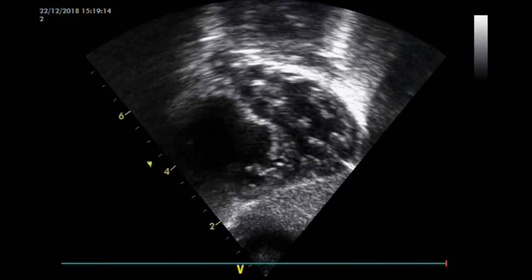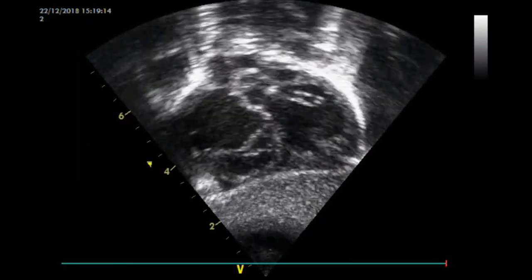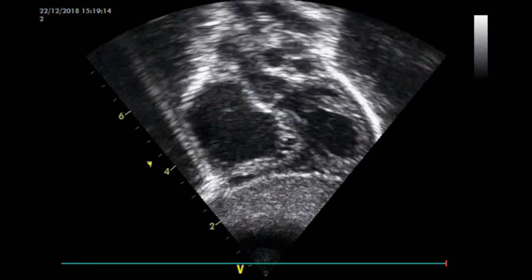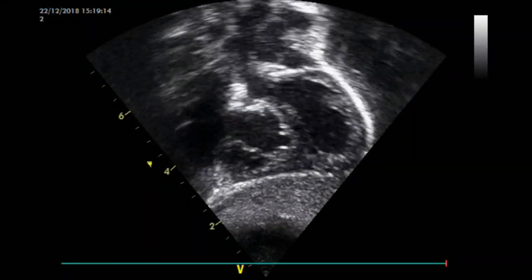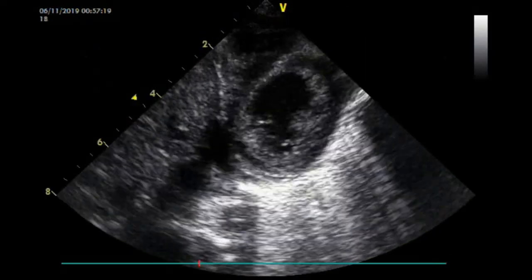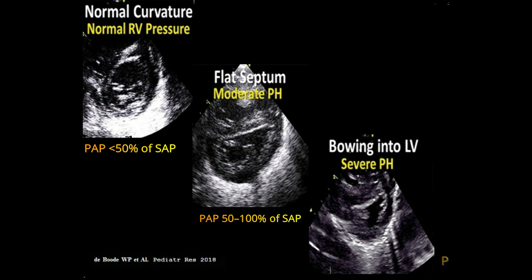In these cases, an alternative estimation of pulmonary arterial pressure is based upon the alignment of the interventricular septum, best analyzed at end-systole in the parasternal short axis view above the level of the papillary muscles. Normally, the septum bows into the right ventricle, giving an O-shaped left ventricle. With increasing right ventricular pressure, the interventricular septum will flatten — D-shaped left ventricle — and eventually curves into the left ventricle, producing a crescent-shaped left ventricle.